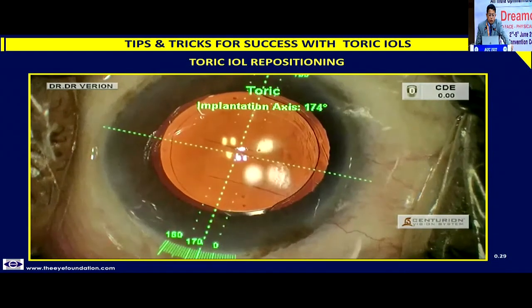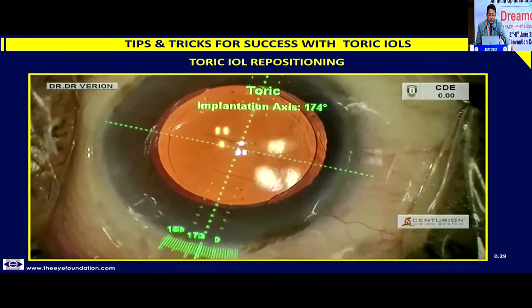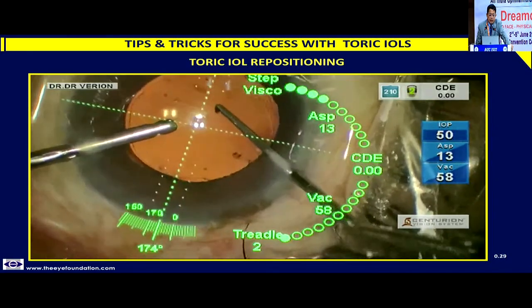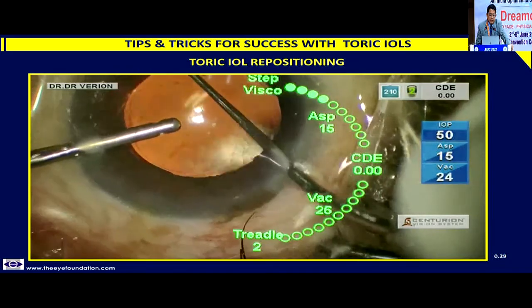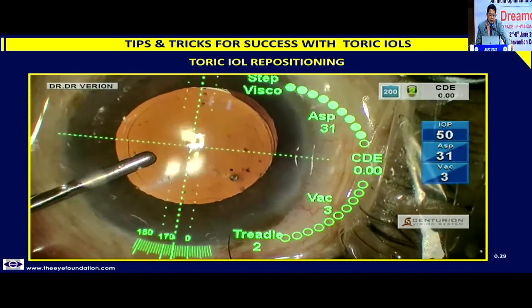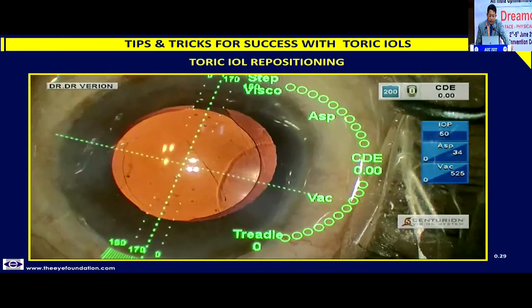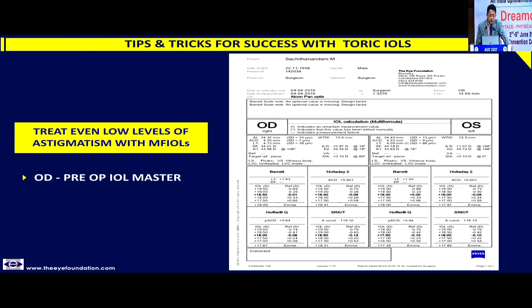I do not use any viscoelastic. Just go in with an irrigation cannula, and with the irrigation flowing, you just reorient the lens so that it coincides with the exact position where you want. You saw that the lens was slightly rotated, and you do not use viscoelastic, because just removal of the viscoelastic, or sometimes leaving behind some viscoelastic, might itself compromise the results. And this is the kind of simple, 2-minute procedure you can do to compensate for that.